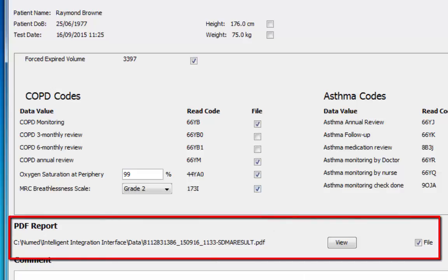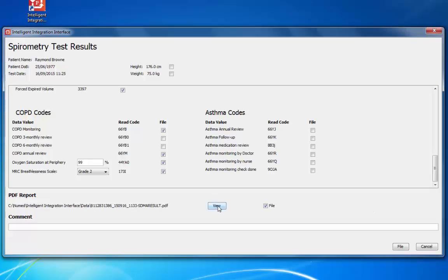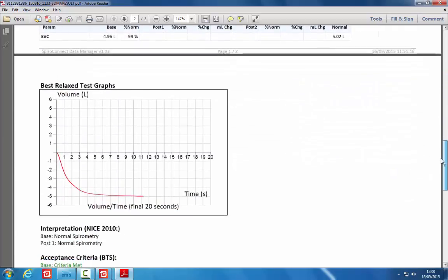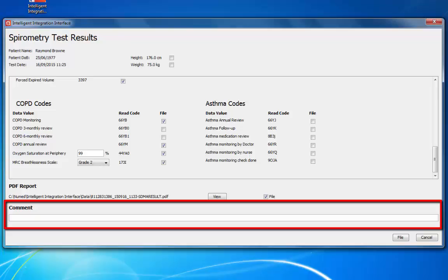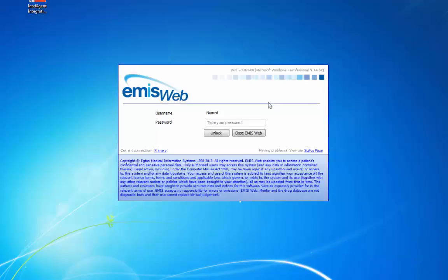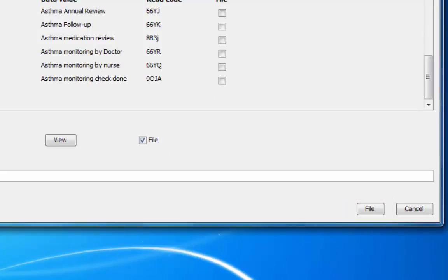The PDF report can be previewed by clicking the View button. The PDF must be closed before the results will file. There is also space to enter an optional comment which will be filed alongside the PDF attachment in the patient record — for example, a note that this is the patient's annual review. When all the required options are chosen, check the clinical system hasn't timed out and locked; if so, unlock before proceeding. Click the File button to send the report and read-coded data back to the patient's medical record in the clinical system.